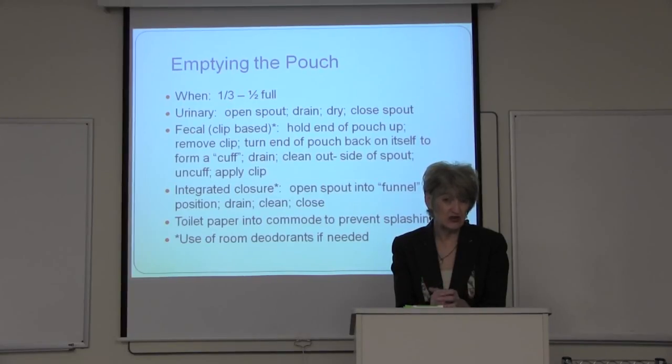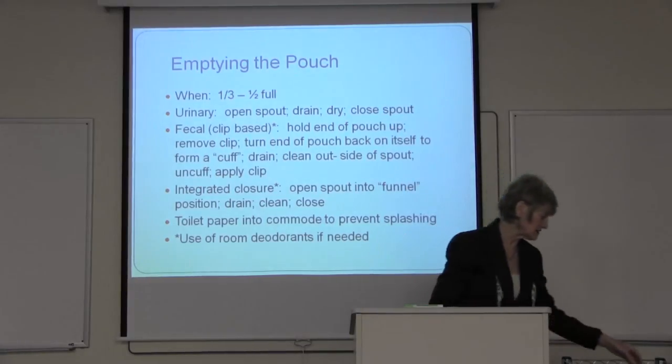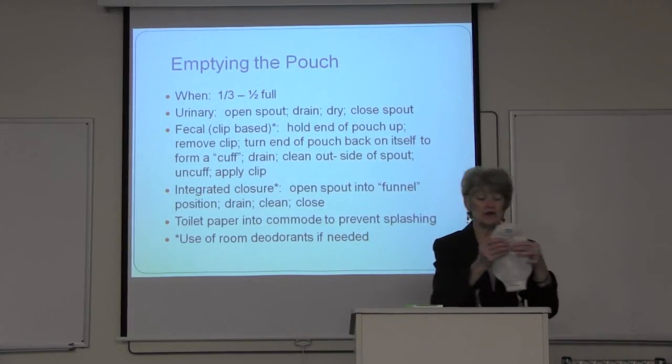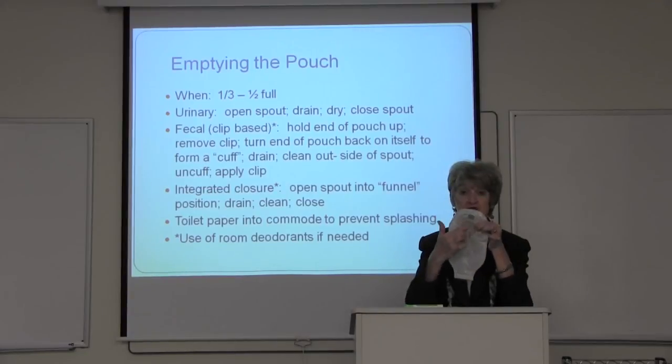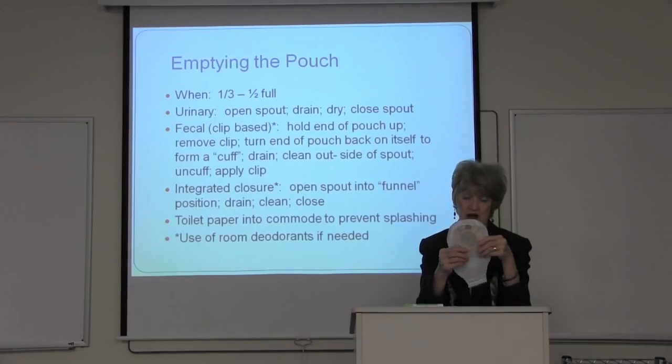So they need to use cool water, and they should not be aggressive, because if they're aggressive and putting water in their pouch, they're going to tend to wash away the protective paste, protective barrier products right around the stoma. So we do not encourage rinsing.